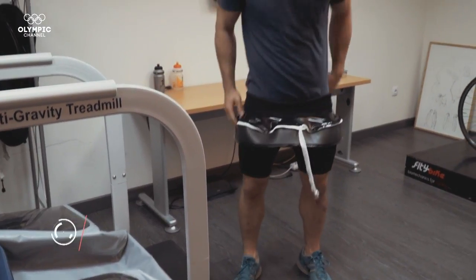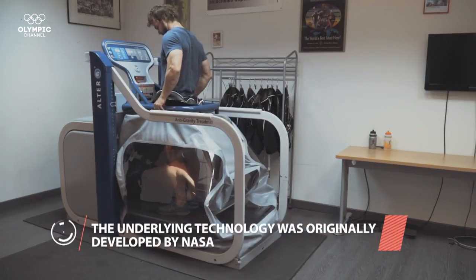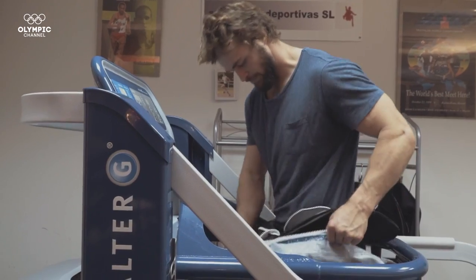Users must wear neoprene shorts that zipper into the air chamber, forming an airtight seal in which the system employs the differential air pressure technology.